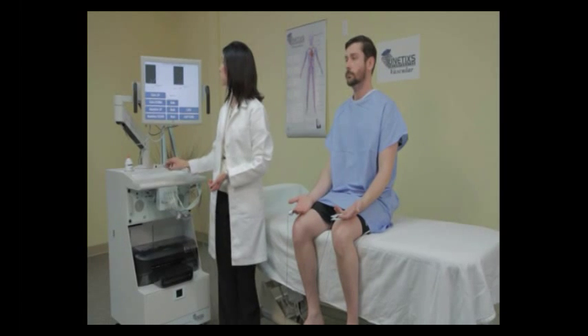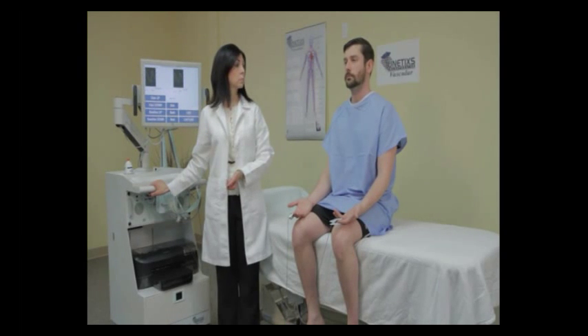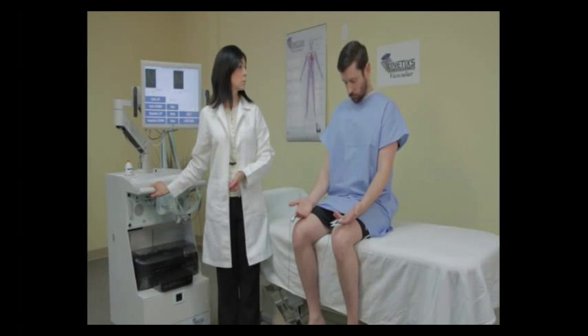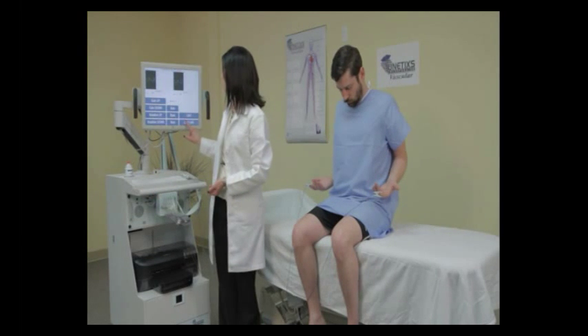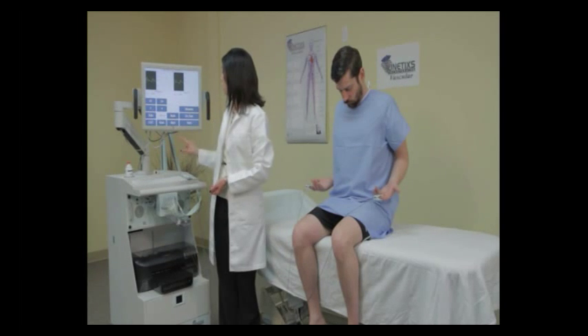When we press next, we'll bring up the next maneuver, which is called the costoclavicular or military position. Ask your patient to take a deep breath, try and bring their chin to their chest, and touch their elbows behind their back. Observe the on-screen waveforms. If they're getting smaller, wait for them to settle down and then capture.